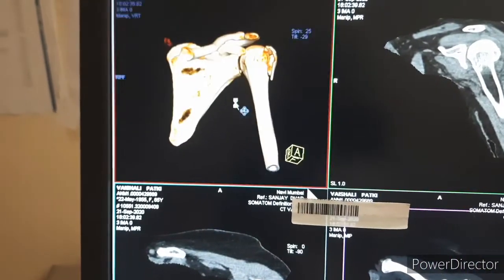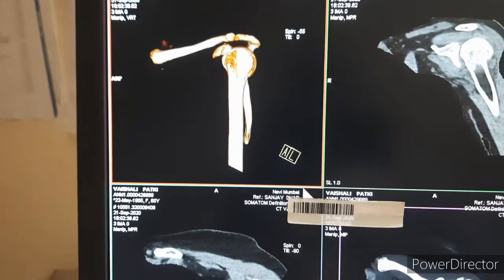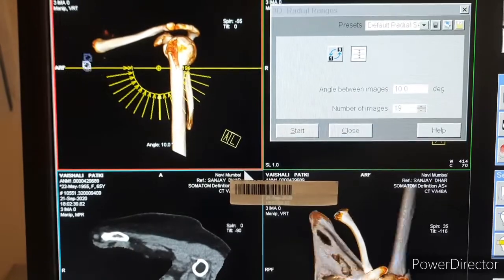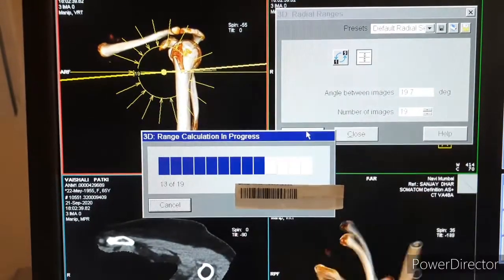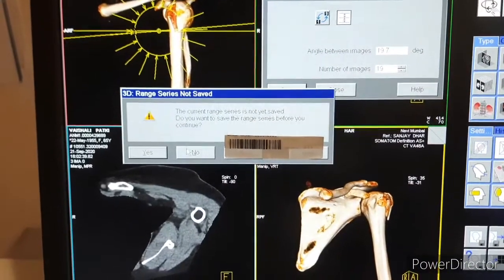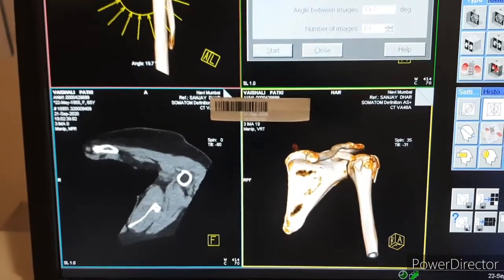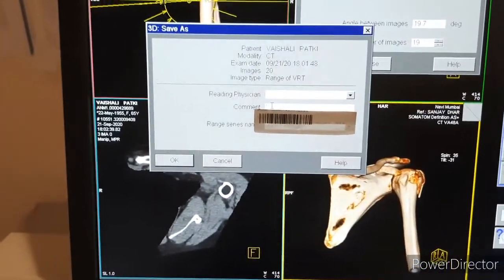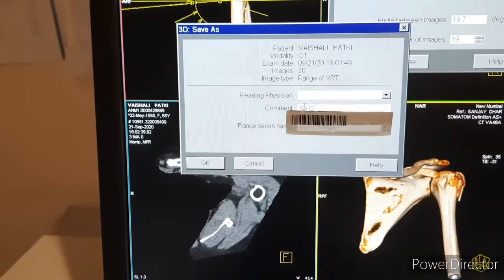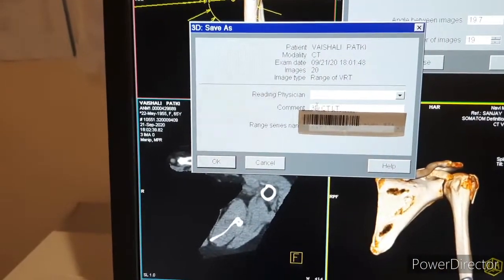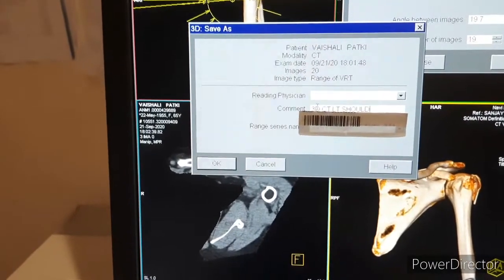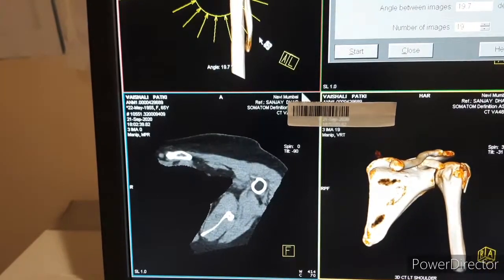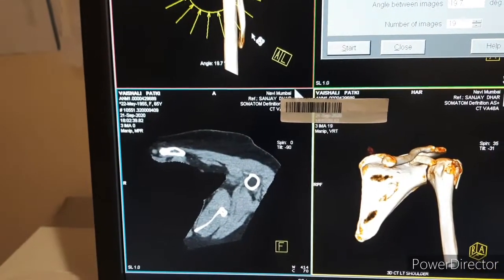Then you can save these images right to left and left to right accordingly. Name it '3D CT Left Shoulder'. This data will save automatically to your data disk.